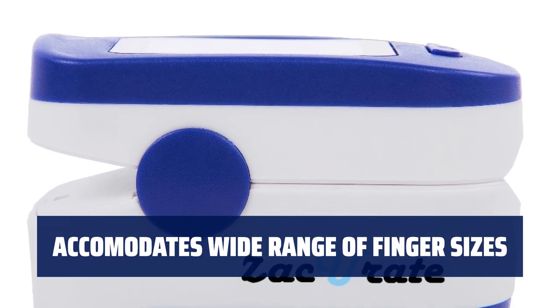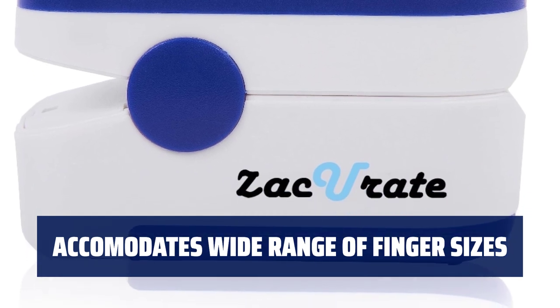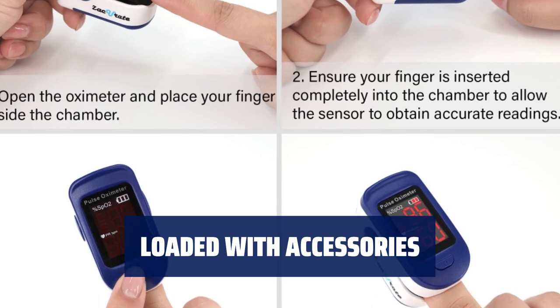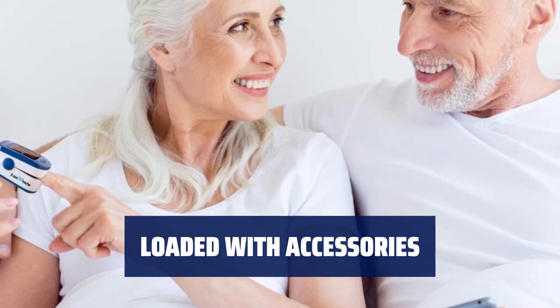The finger chamber with smart spring system accommodates a wide range of finger sizes, suitable for ages 12 and above. Comes with 2x AAA batteries for immediate use, a 12-month warranty, and USA-based technical phone support for your convenience.